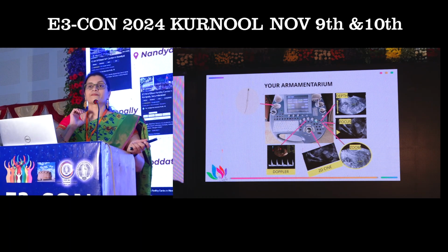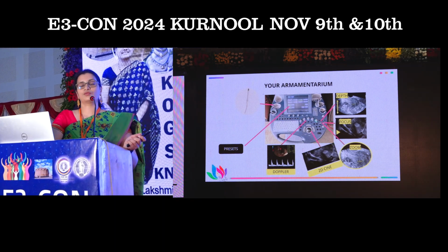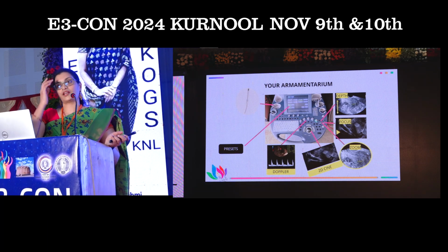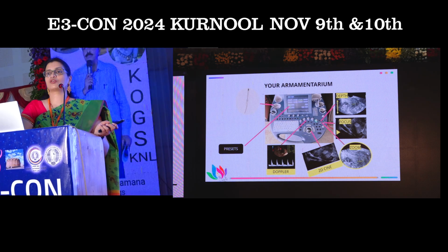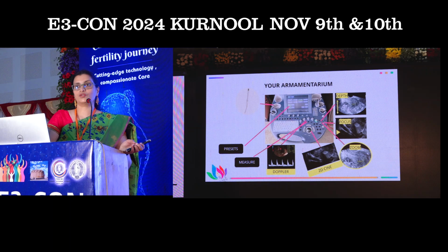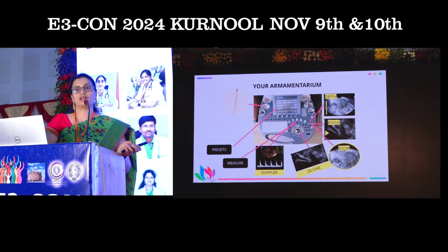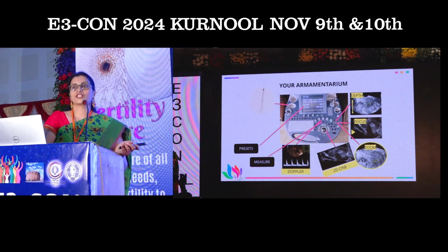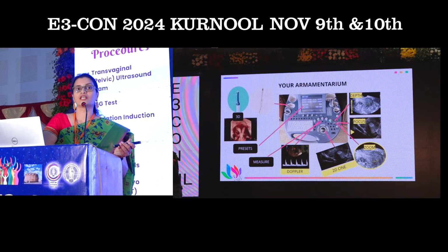small vascular flows. And to make all these adjustments quicker and make your examination quicker, you can save all these with adequate depth, focus and all, and then save it as a preset, so that you can simply switch it on when you are starting an examination. And always measure all the organs, whatever the normal organs, the uterus, ovaries, and also whenever we find any other masses or abnormal findings, we need to measure them to quantify our findings. And as I said, 3D is optional.